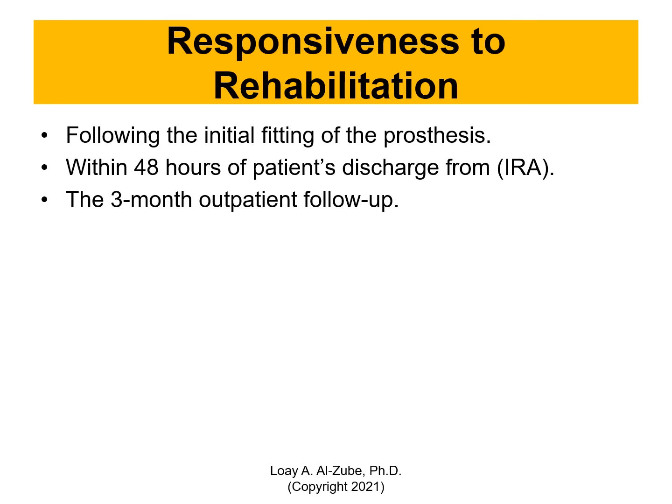Okay, responsiveness. After we do the initial fitting of the prosthesis, we need to make sure the subject is using it, and within 48 hours of patient discharge out of the inpatient rehabilitation admission, we should get a survey and feedback from the subject.